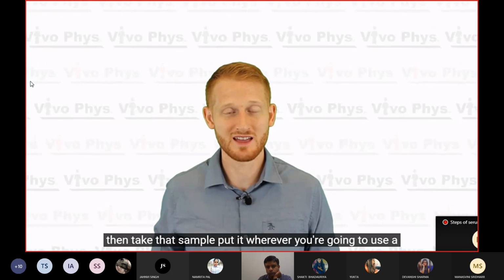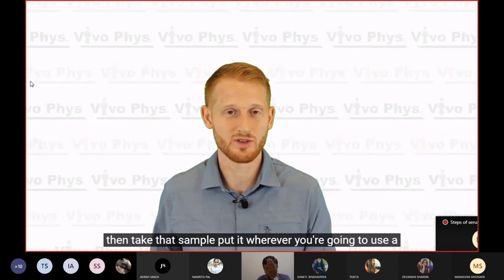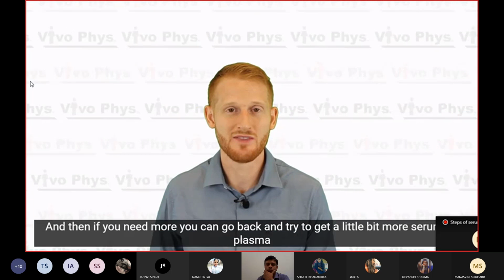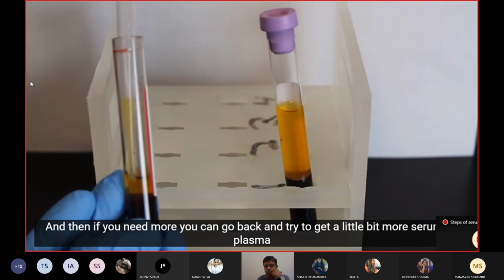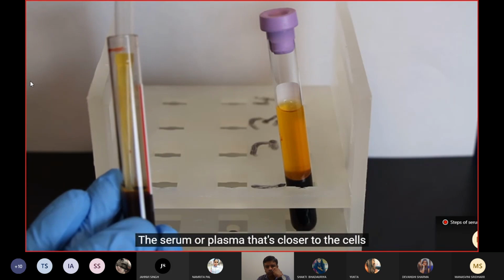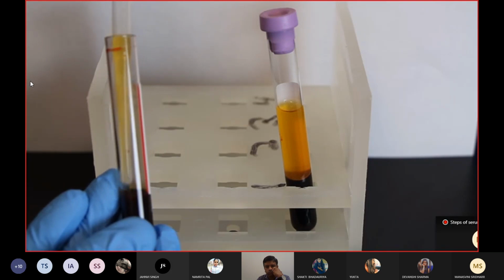Then take that sample, put it wherever you're going to store or use it, and then if you need more, you can go back and try to get a little bit more serum or plasma, but you want to make sure that you get the easy serum and plasma first before you start getting a little more gutsy and getting the serum or plasma that's closer to the cells.